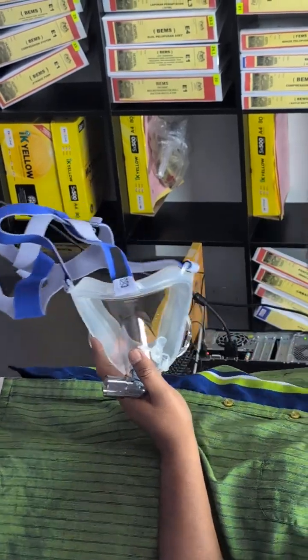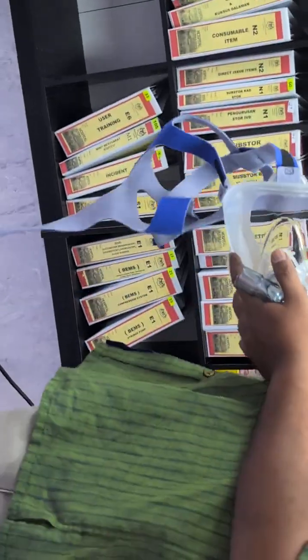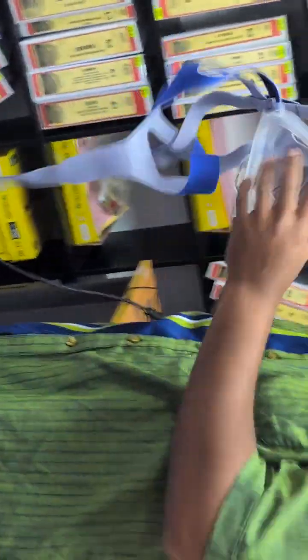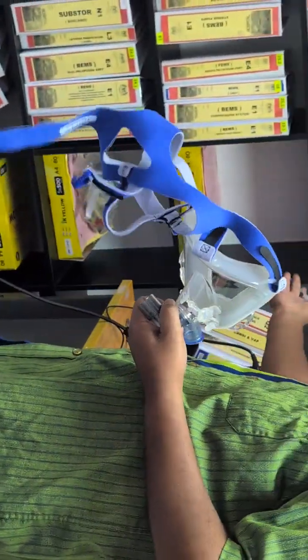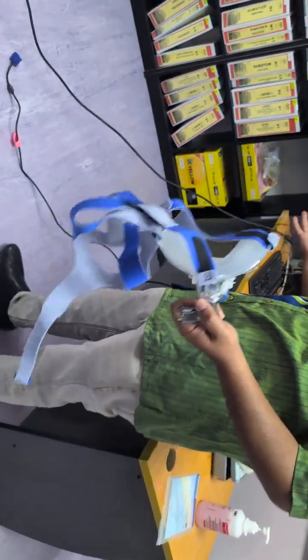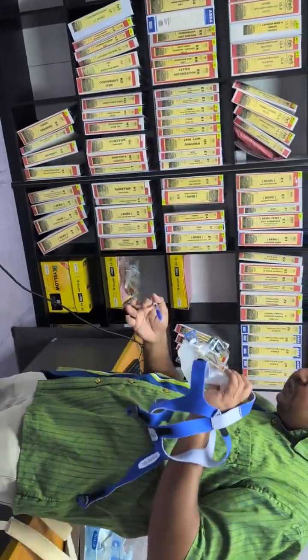I promise you, the 11th time it will be destroyed. So use a cold sterilizer. Just put it into the high level disinfectants and take it out, because it's the same. Whether you burn it or put it in cold sterilization, it's the same. So do not autoclave. Alright? Any questions, ask me again.